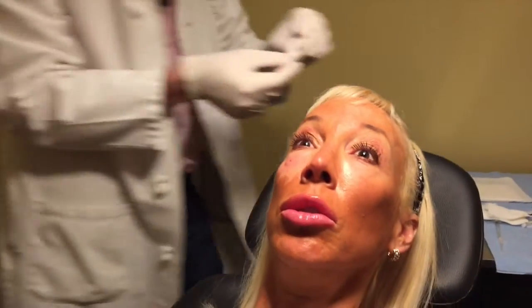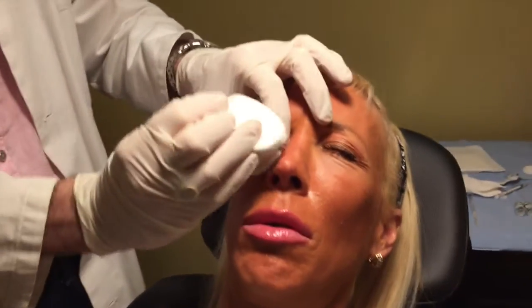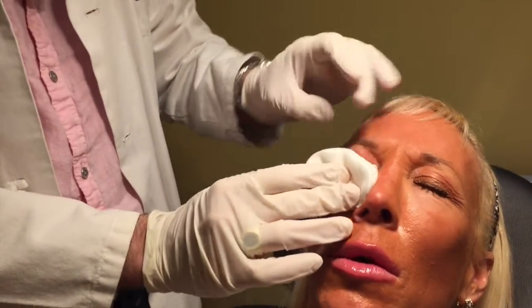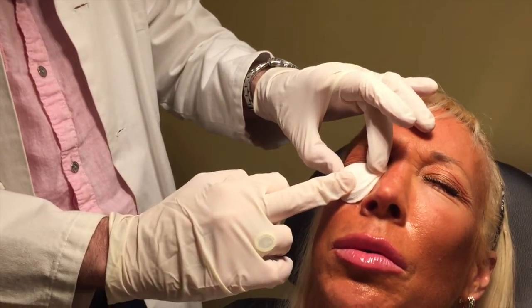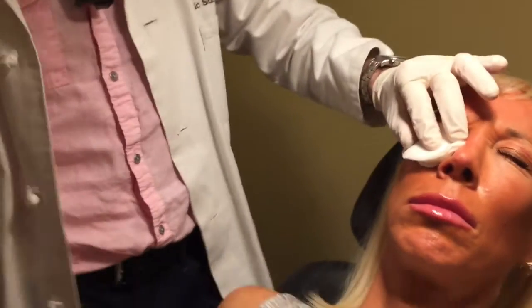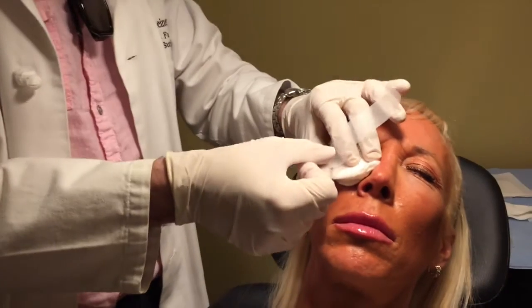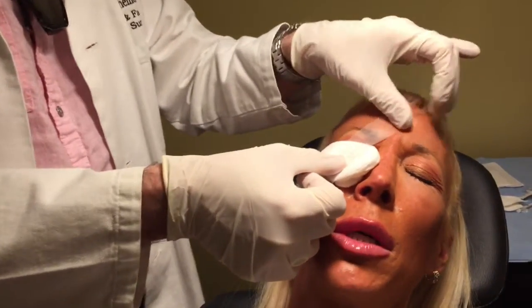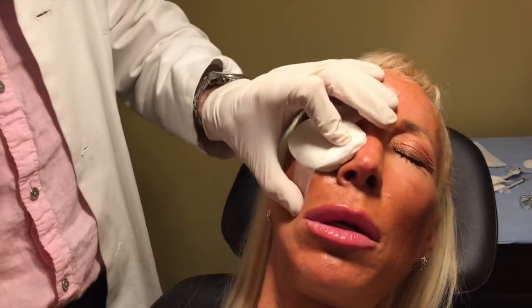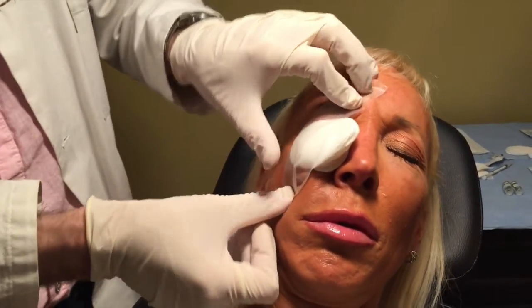Okay. Next, what we're going to do is to put the eye pads on the areas where we injected the hyaluronidase, where the hyaluronic acid was. We're putting this under pressure, so I fold one eye pad first, and then I put a second eye pad on top of it. We then use tape, and we will be securing these two eye pads with tape from the center of the forehead to the cheek region. I usually pick up the cheek a little bit to create a little more pressure there.